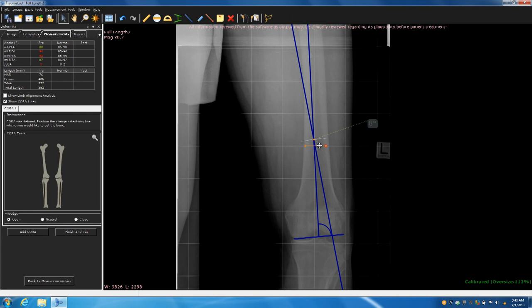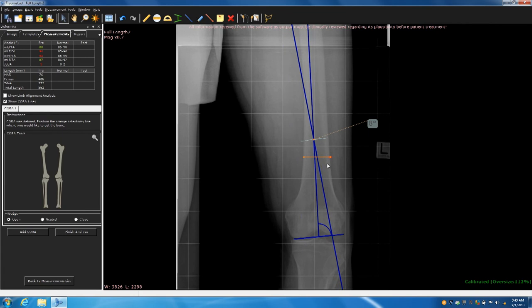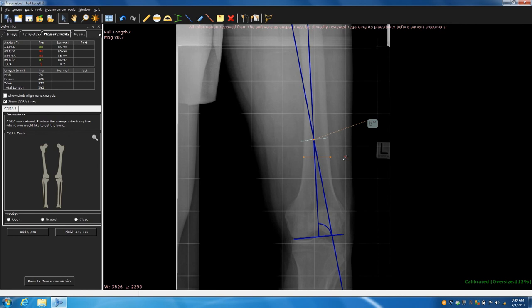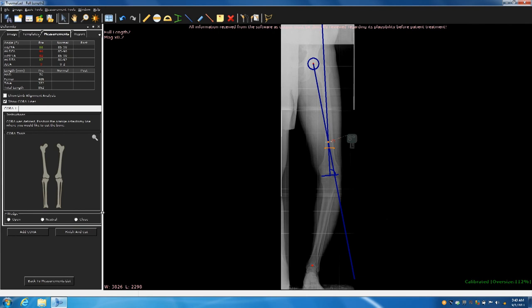You now want to find your distal deformity. You then go over the femur. The distal femur, remember, if you start mechanical, you've got to stick mechanical. So you want to choose the mechanical distal femoral joint line. And you automatically get your CORA. It gives you your magnitude of eight degrees. It gives you an osteotomy. And you might say, well, I want to use a plate. Or you might say, I want to use a rod, but I don't want to perform my osteotomy at that level for whatever reason. You can move your osteotomy wherever you like. Remember, the translation is going to be the amount of space between these two axes. But if you notice, your hinge point automatically goes with your osteotomy. It's just the way the program is written. So right-click on your rotational axis, your hinge point. And then you want to hit user define and then place your hinge point on your correction bisector line.